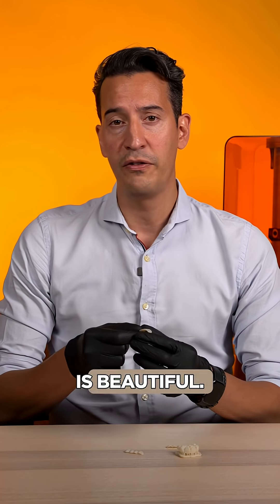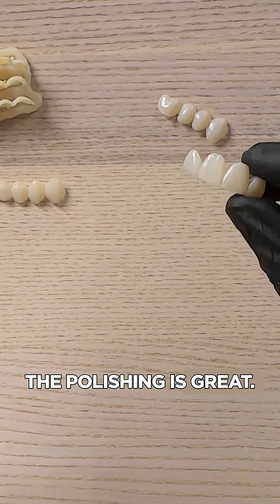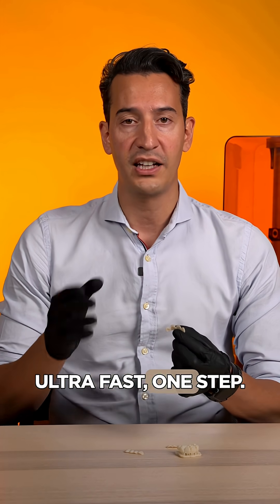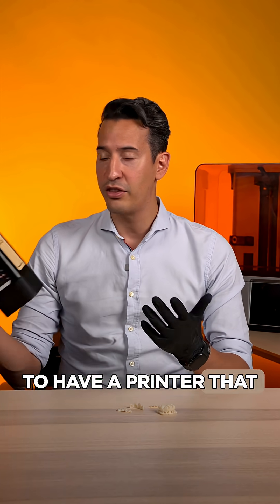What are the pros and cons of this shell markup? Pros: it looks amazing, the texture is beautiful, we can print around 0.5 millimeters, the polishing is great — we almost touch it — and it is ultra quick, ultra fast, one step.